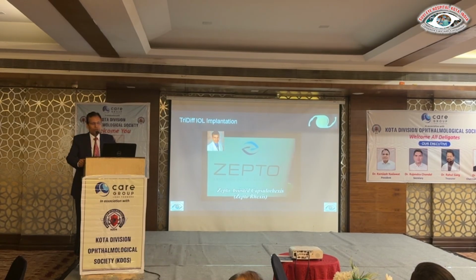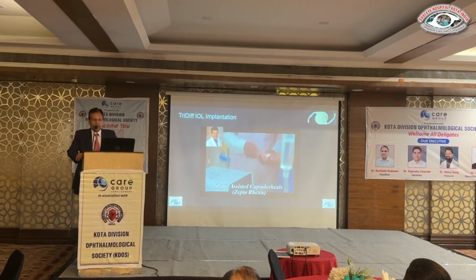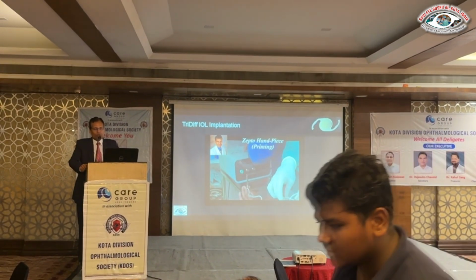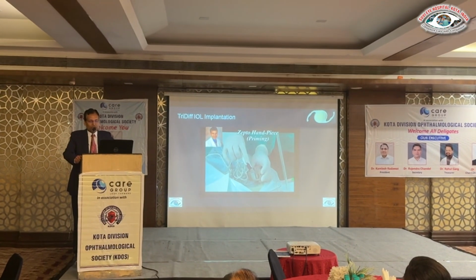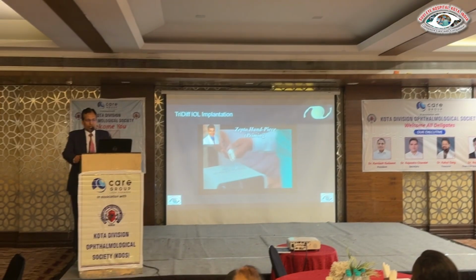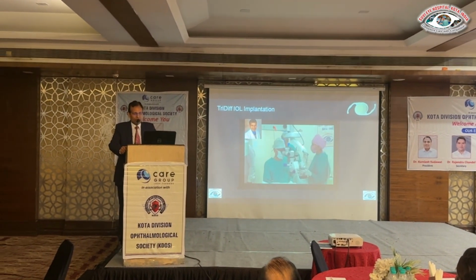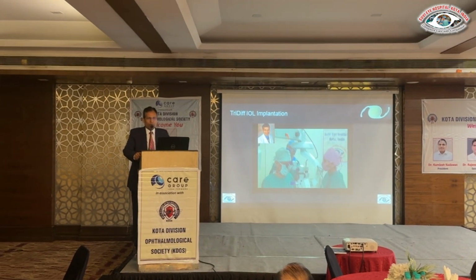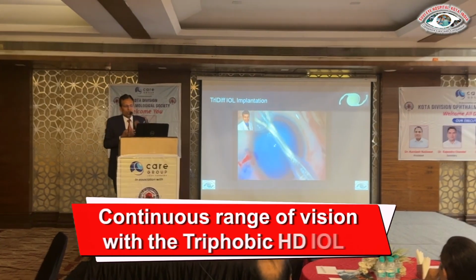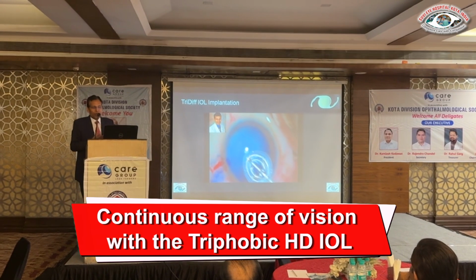Here we used the Zepto nanopulse technology to perform the capsulorhexis. As we know that the capsulorhexis in these cases is difficult because of the associated positive intralenticular pressure. Once you start the rhexis, then the capsulorhexis or the capsule may run away, and this is known as Argentinian flag sign. So once the capsulorhexis is not perfect, then your plan to implant the premium lens such as the EDOF lens or multifocal or trifocal lens or toric lens can be in trouble.